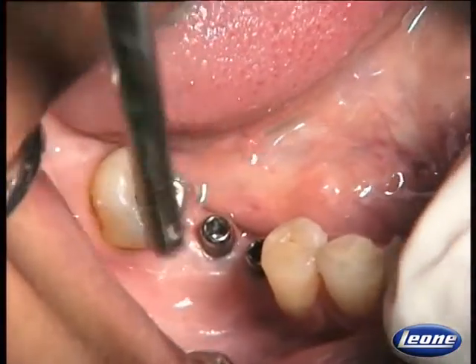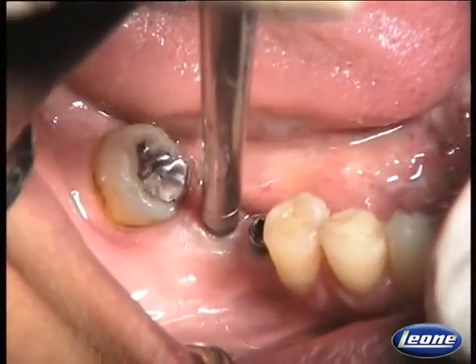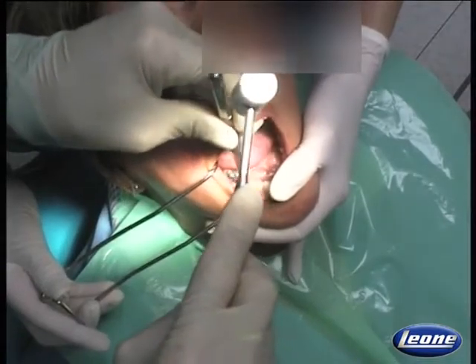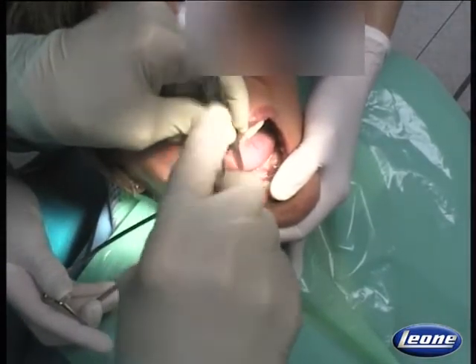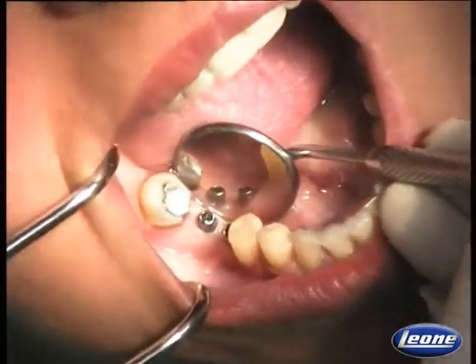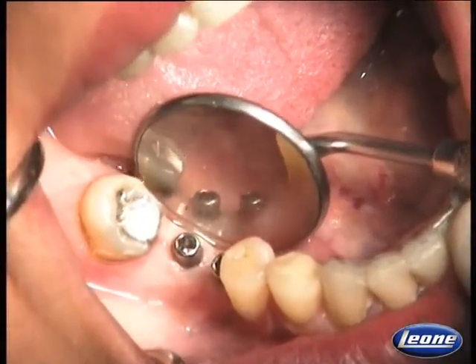In order to activate the Morse taper connection of the healing caps, you can use the specific beater or a rod like this and a mallet. Now the healing caps are, again, correctly seated on the implants. During the next visit, we will deliver the final restorations.